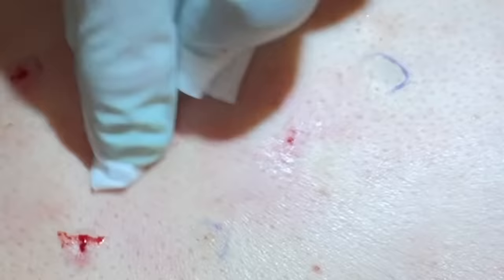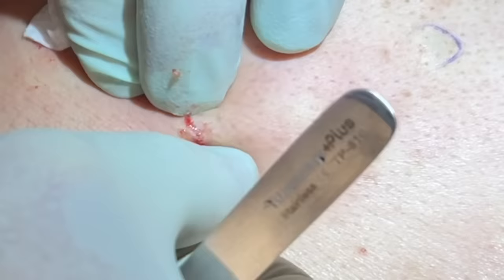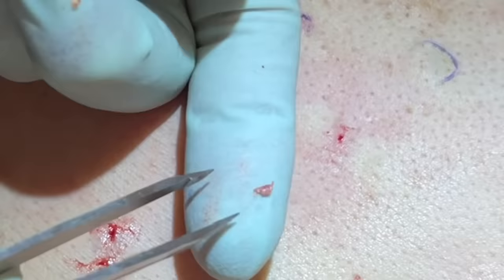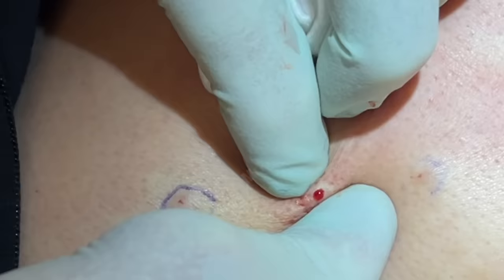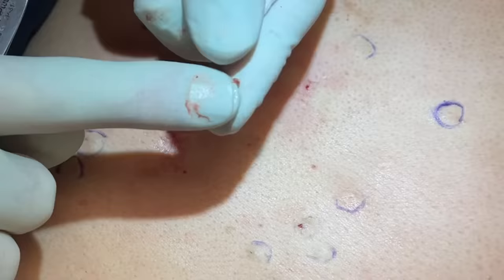Small ones are very tricky — got to rough it up a little in there to try and get that out. I ended up getting all of them — just a little circle of hair and a little bump. You can see that's way different; that could be the sac just starting there. Got the fourth one there. Took some squeezing, that's why I had to numb them. You see these little tiny sacs — every one of them has a little curled hair there, just a little keratin.